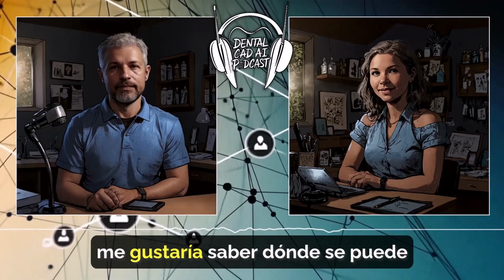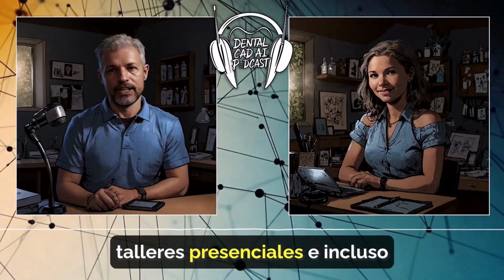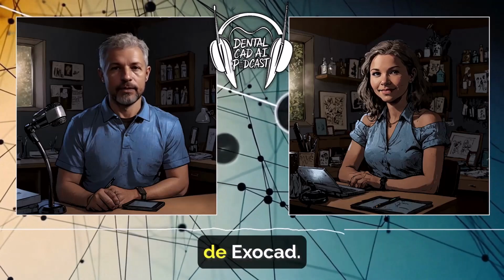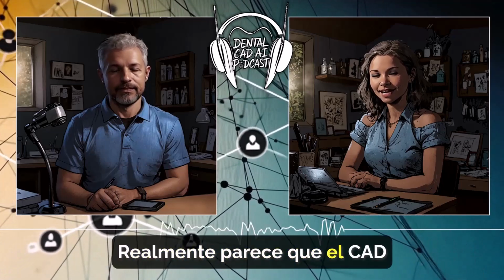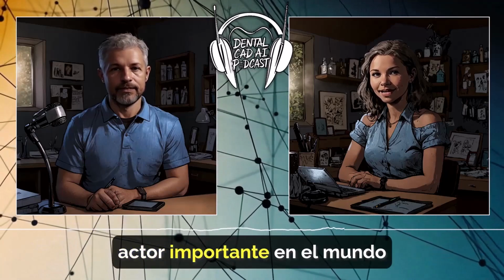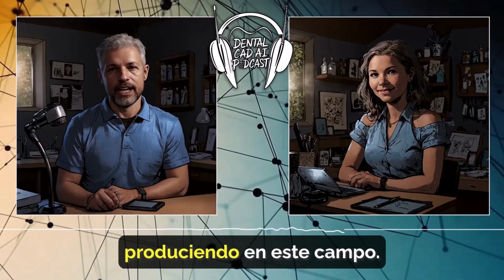But before we wrap up, I'm curious, where can people go to learn more about DentalCAD 3.2 Elefsina? Oh, there are tons of resources available. CAD offers online tutorials, in-person workshops, and even personalized online training sessions with CAD experts. So if you want to geek out on the details, there's plenty of info out there. It really seems like DentalCAD 3.2 Elefsina is going to be a major player in the world of digital dentistry. I completely agree. It's a testament to the incredible innovation happening in the field.